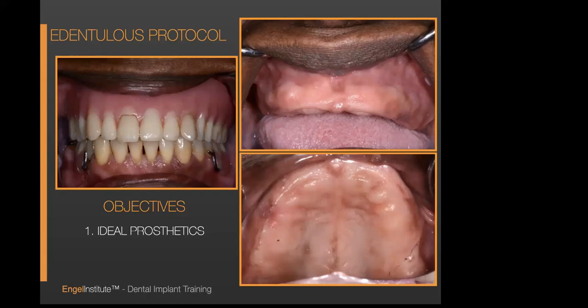And the reason that this is my favorite, I'm going to tell you, is because the teeth are already out, the patient's already in a denture, so all of that morbidity, all of that pain and blood and extraction, just headaches for everybody are behind us. So guys, I want to encourage you, if you have a patient that walks in like this, this is a needle in a haystack. And if you've got these, you want to work with these. Okay, so what do we do at this point?